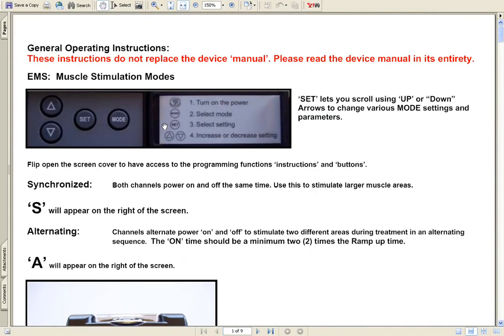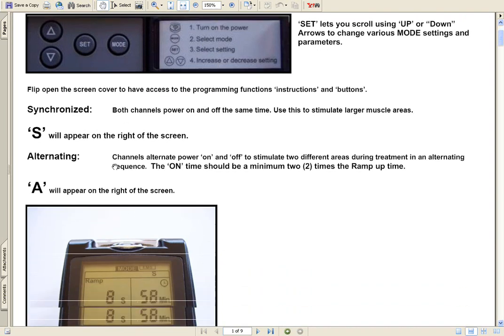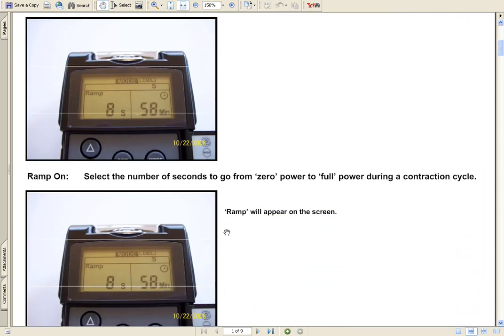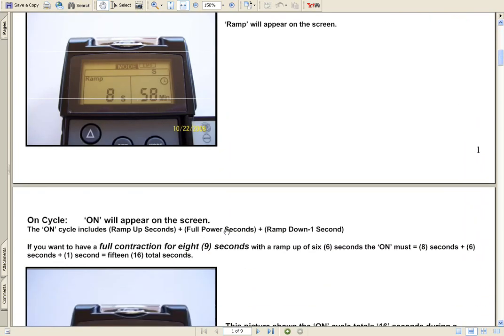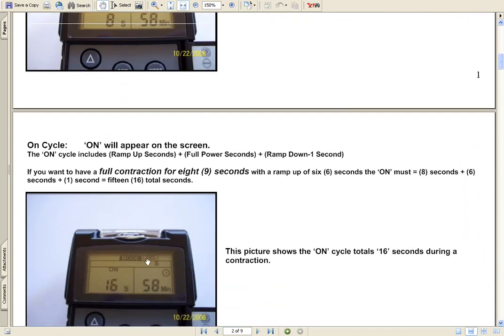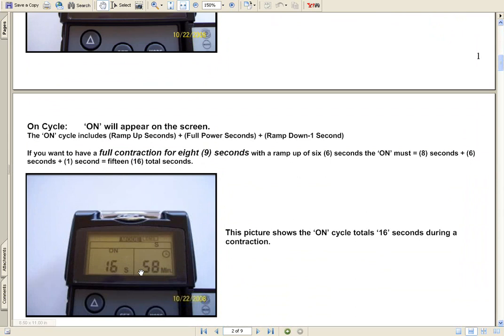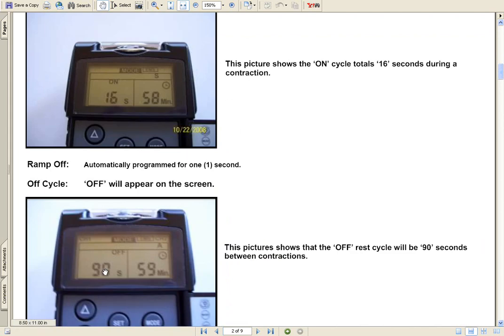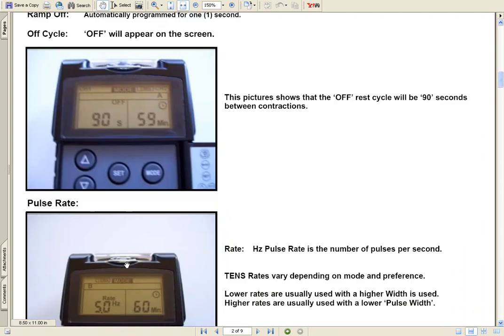So you can see we take screenshots, our tutorials, we'll have screenshots. If you're taking the tutorial on the QuadStar 2 or the Impulse HVG or the TwinStim 2, we have screenshots. So here you can see S means synchronized, meaning both channels. This is an 8-second ramp up. See, on this device it would say EMS on 16, so that means it ramps up in 8 seconds, 7 seconds on at full power, then it goes off to zero. Then it's off, say 90 seconds, it stays off until it goes back on.